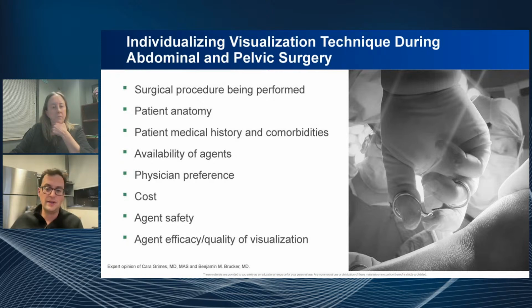There have been times when we were transitioning from sodium fluorescein back to indigo carmine, where we had sodium fluorescein and I'd ask for something else. Finally I said to the OR, look, I want to have this in the Pyxis. I want it available. And now everyone knows it's on my preference list. Different physicians have different preferences, and that's okay. There may be cost concerns. There are the agents and their safety. And then the final piece is getting comfortable with the efficacy and the quality of visualization. Those are the things that drive why you'll use one dye or one technique versus another.